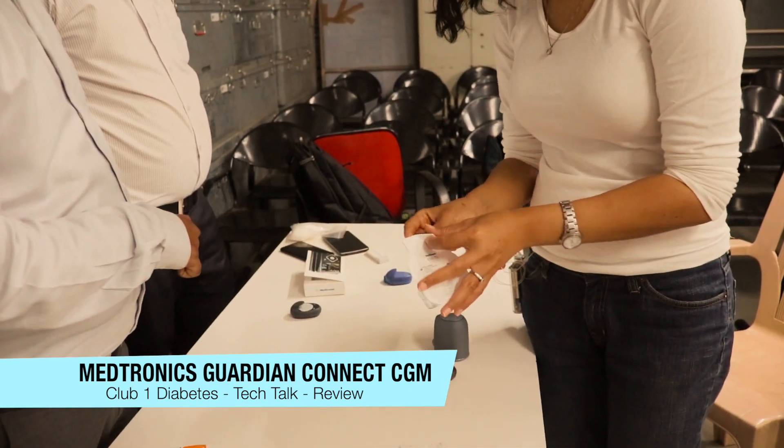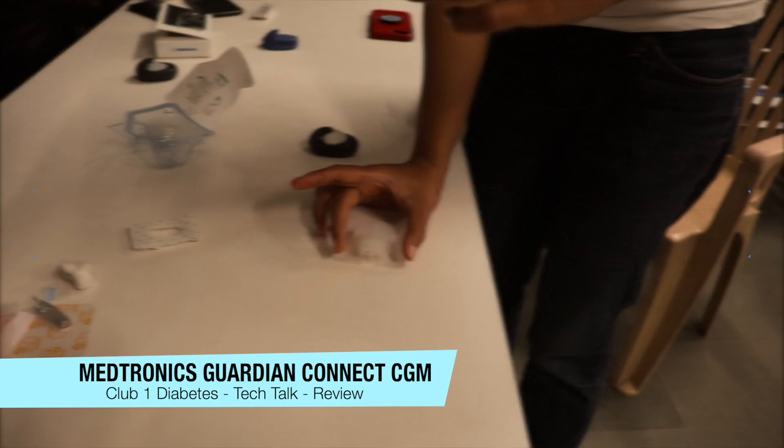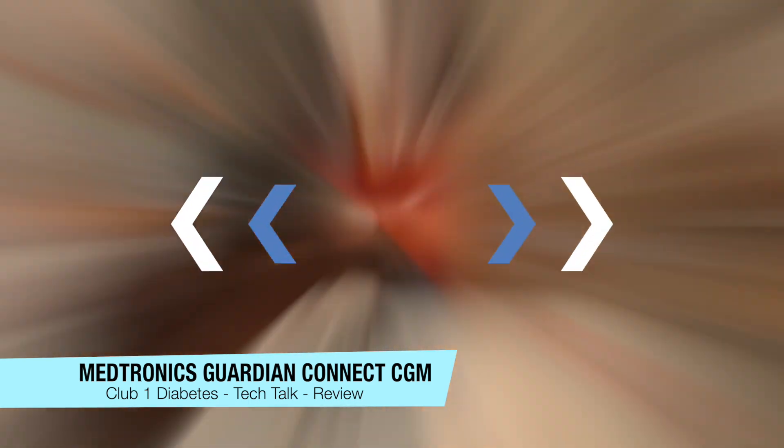Now we move on to the application of the CGM on the body. You might need to use an alcohol wipe to clean the skin to apply this white sensor, which you see in my hand. The grey inserter helps inject the sensor into the abdomen.